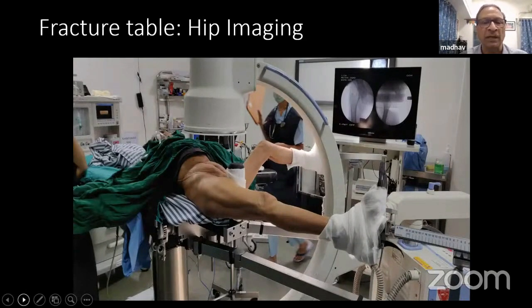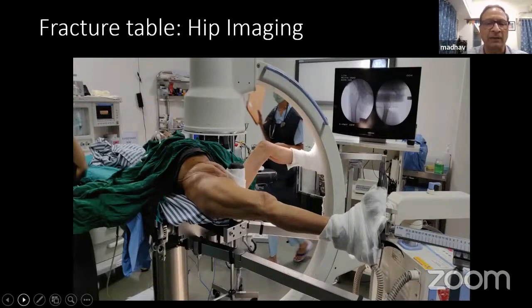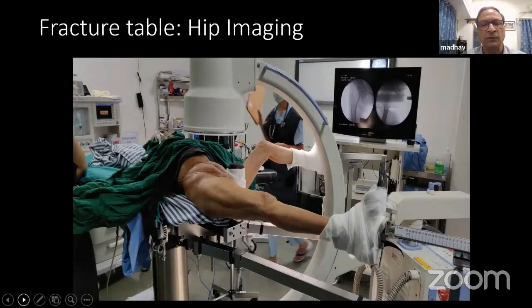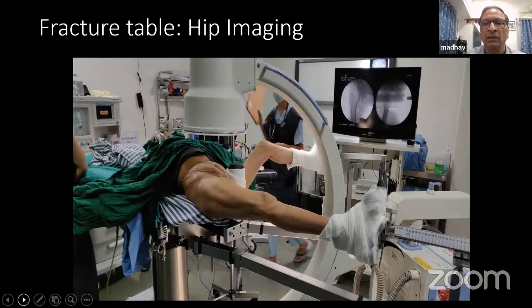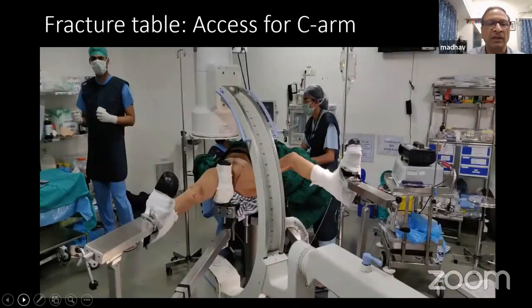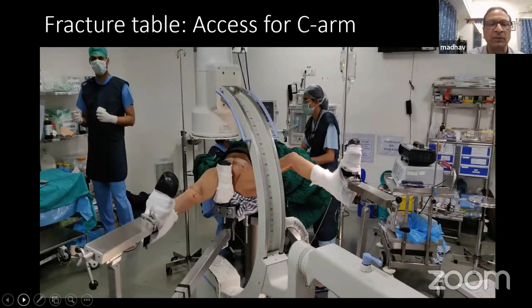It could be either an intracapsular fracture of the neck of femur, or it could be an intertrochanteric or subtrochanteric fracture, which most orthopedic surgeons prefer doing on a fracture table. Here is the view of the operation theater where an anesthetized patient with an intertrochanteric fracture is fixed on a fracture table.